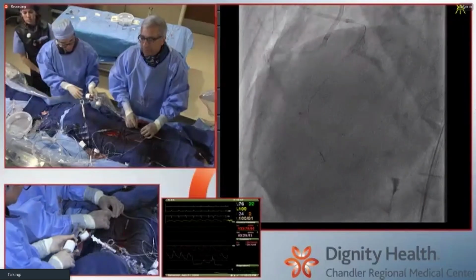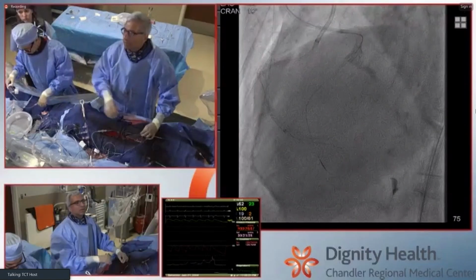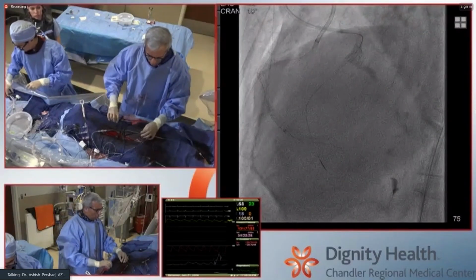I think he kept the pressures pretty low. There was a question about what the pressure was that you used with your 2.5. I assumed you were pretty low. Just massage like normal, like 8.